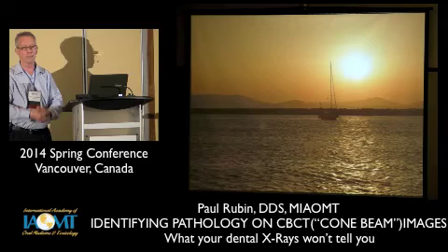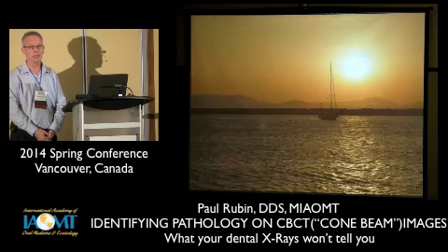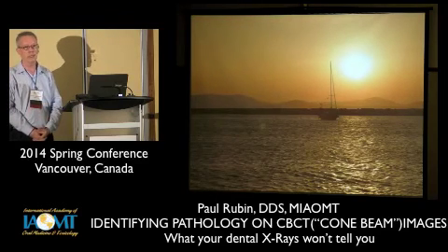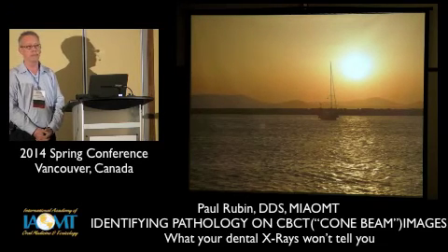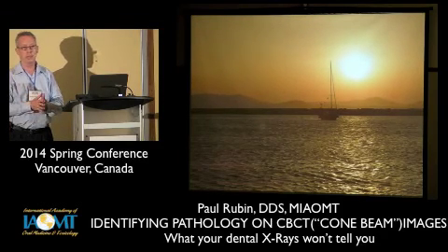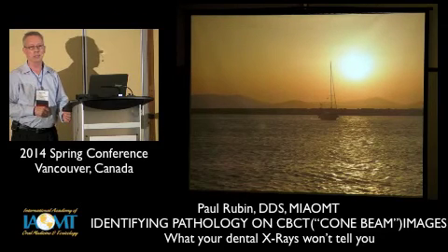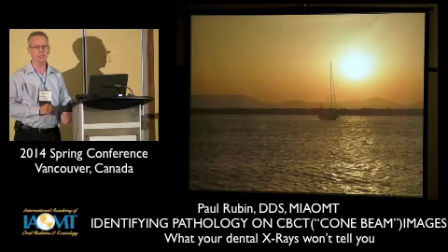And do they always appear below the cortex? Sometimes you don't even see a cortex; you can see it's just medullary bone there. He asked if it always appears just below the cortex. Not always. Sometimes it can be down deeper. Sometimes you just drop through that cortex, and right below that paper-thin cortex, there's this big void. Sometimes it may be the remnant of a little tiny root fragment that's way down deeper, with fairly solid bone above that. But again, you can get a sense of where that defect is three-dimensionally, and you know sort of where to aim when you're starting the surgery.